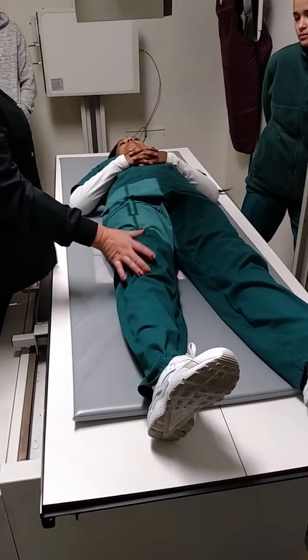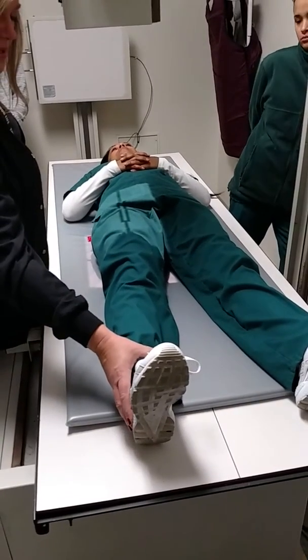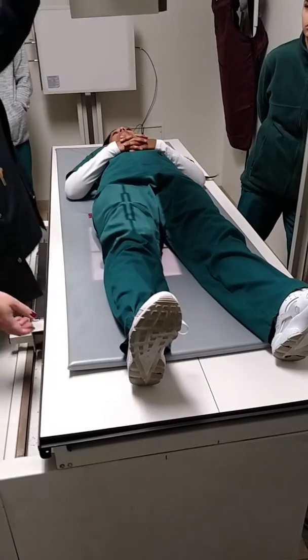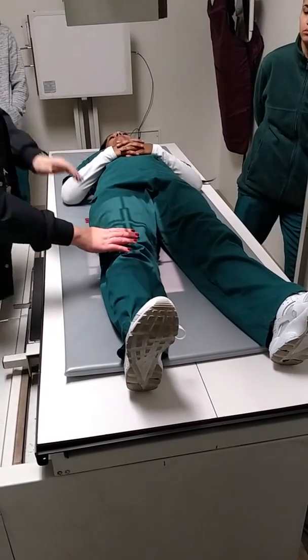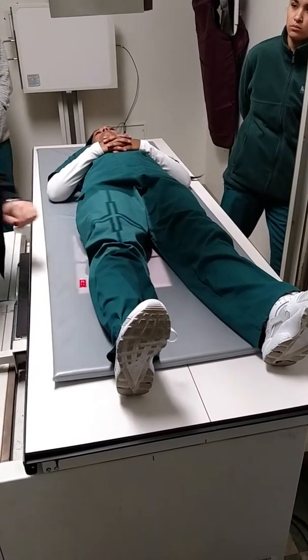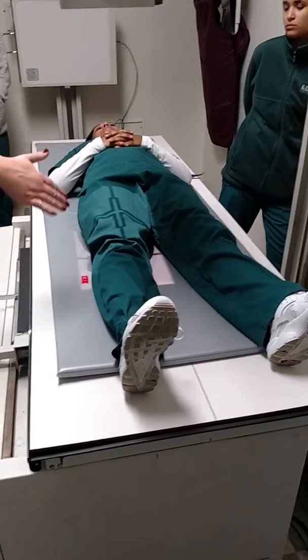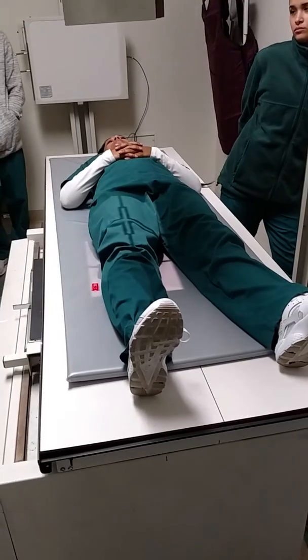Now I need to get this part of her femur, but to make that an AP, it only takes 5 degrees. So we're going to take some of that off, and then I'm going to come down below. Realign all that. Okay, below the knee joint. Hold your breath, beep. So that's an AP of the entire femur, 15 to 20 for the top, 5 degrees for the bottom. Can I shield for this one?